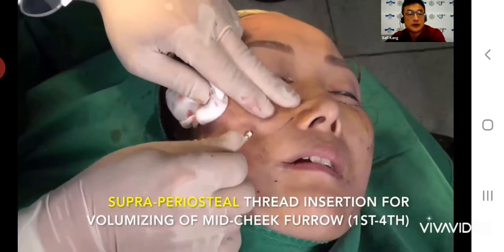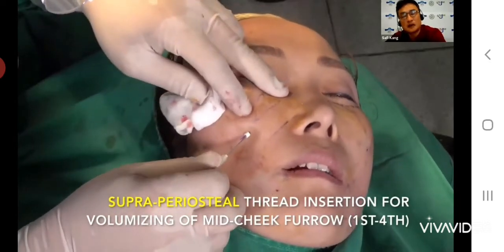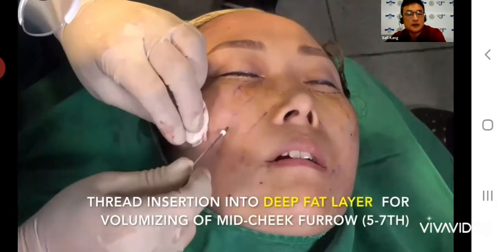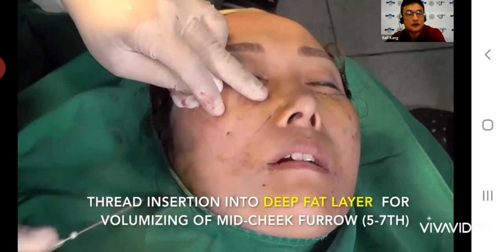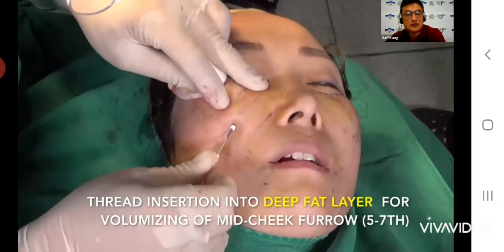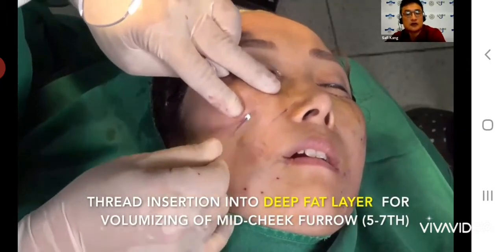After insertion, the patient feels some fullness like a filler, but with a slightly harder feeling. After insertion of at least 5, sometimes 10 or 11 threads, the patient is very satisfied with the volume augmentation. So I didn't use any filler.